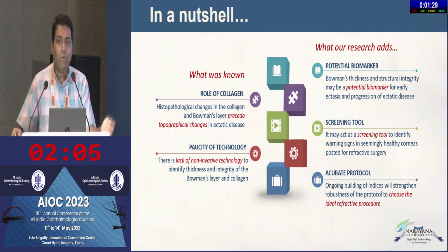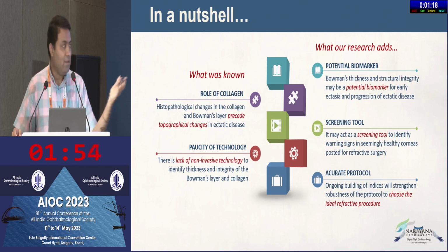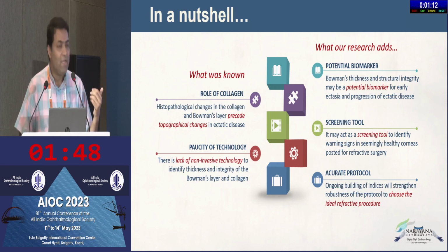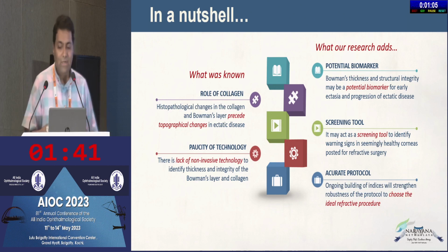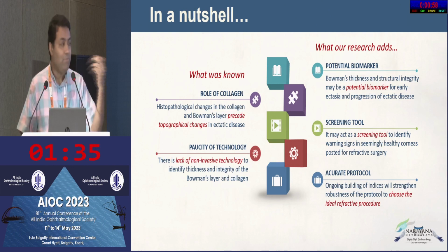And I keep quoting Dr. Sri Ganesh's paper, and he and Sheetal Brar had that big series of Smile Extra. But when you have a clinical paper, you need proof. And recently I was presenting in the Smile Users Meet that the collagen changes after Smile Extra were completely different compared to what you do with just Smile. So most of your clinical data needs proof, and imaging the collagen helps you to get that proof.